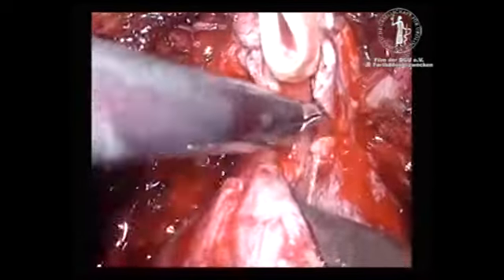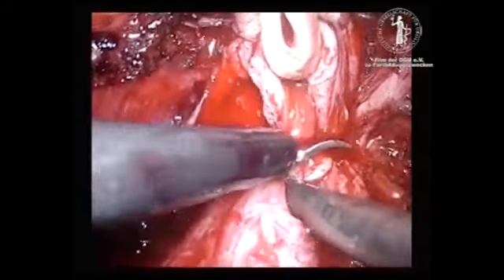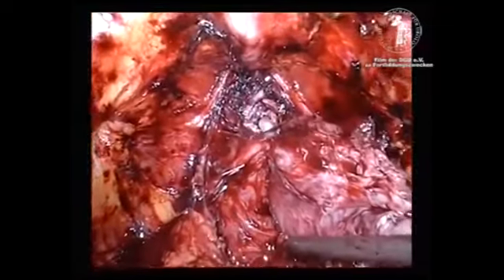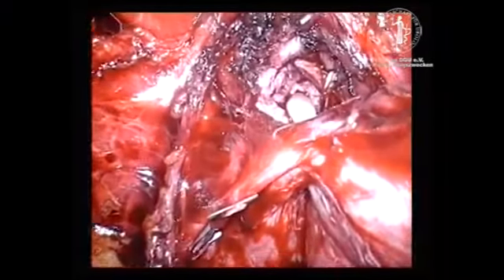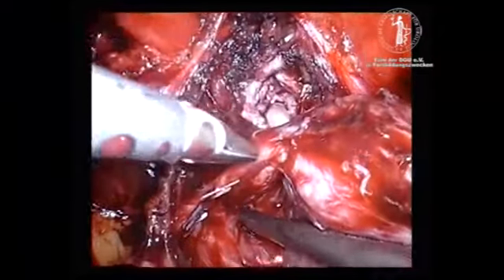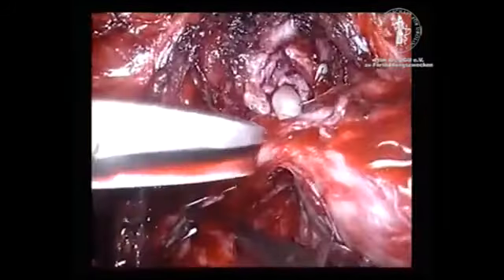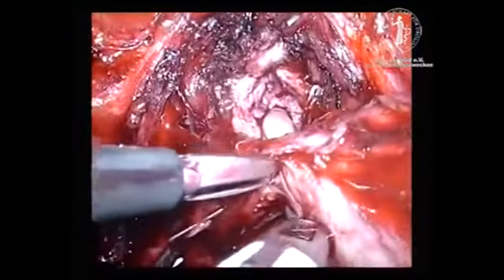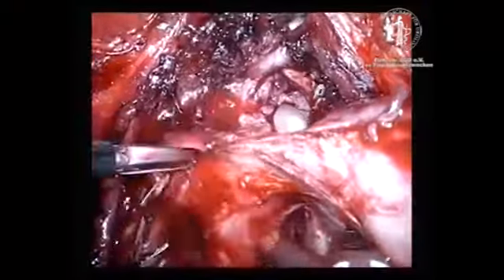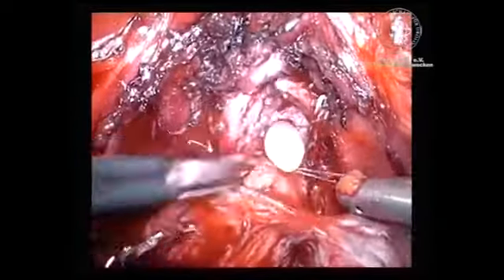As soon as the urethral catheter becomes visible, the assistant retracts the catheter towards the symphysis. The verumontanum is now clearly visible. The dissection of the posterior urethra starts distally to the verumontanum. The final detachment of the posterior urethra is performed dorsolaterally to avoid any injury to the neurovascular bundles and the rectum. The assistant retracts the seminal vesicle contralaterally out of the pelvis and also pushes the prostate dorsolaterally. Then the dissection is performed as a mixture of blunt and sharp dissection using the scissors.